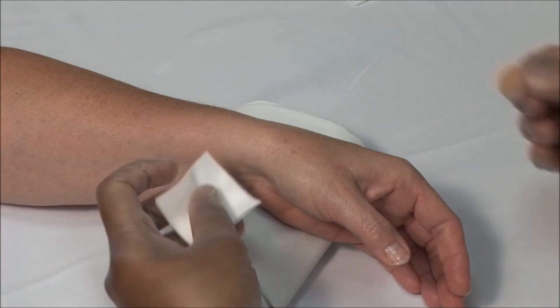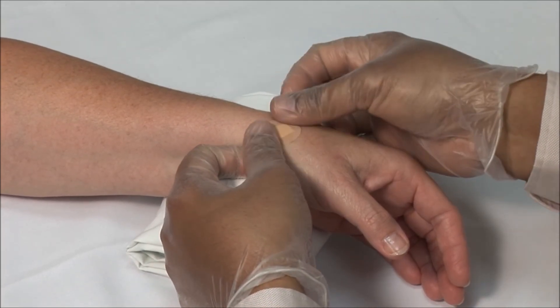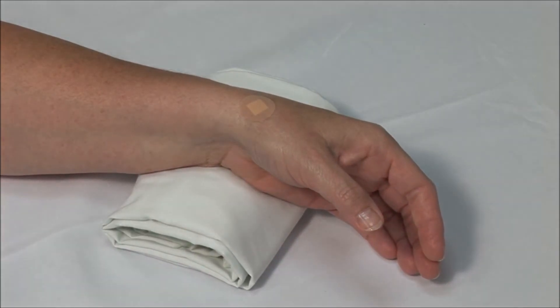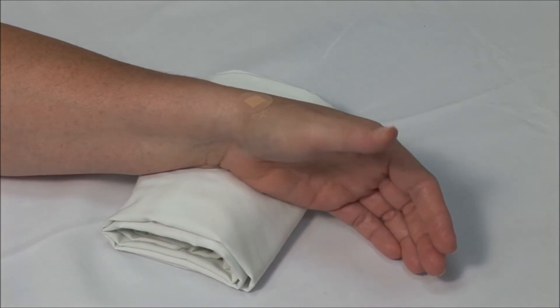Dry the area and apply a bandage. Ask the patient to flex and extend the thumb. Pain relief can be almost immediate.